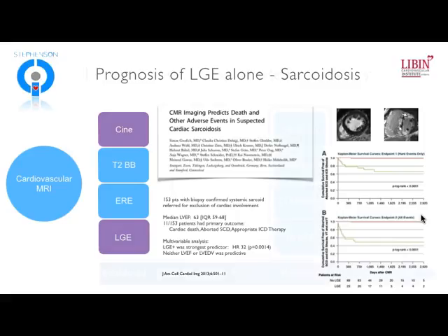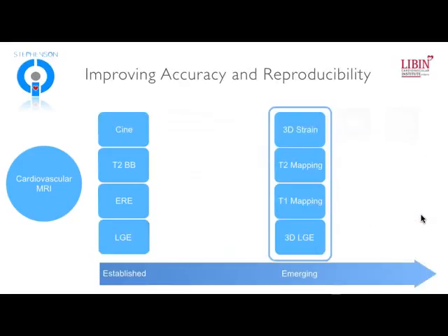And this is consistent with the type of work that we've seen coming out for sarcoidosis, a different form of myocarditis, granted, but still nevertheless an inflammatory myocardial disease, where we see that late gadolinium enhancement is really the dominant predictor of adverse events. And in this case, having a hazard ratio of 32 in a patient population with confirmed pulmonary sarcoid being evaluated for possible cardiac involvement.